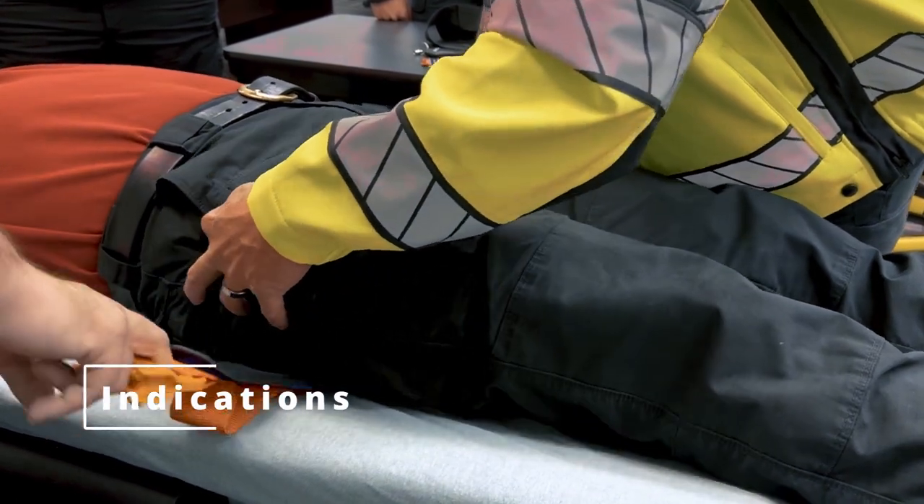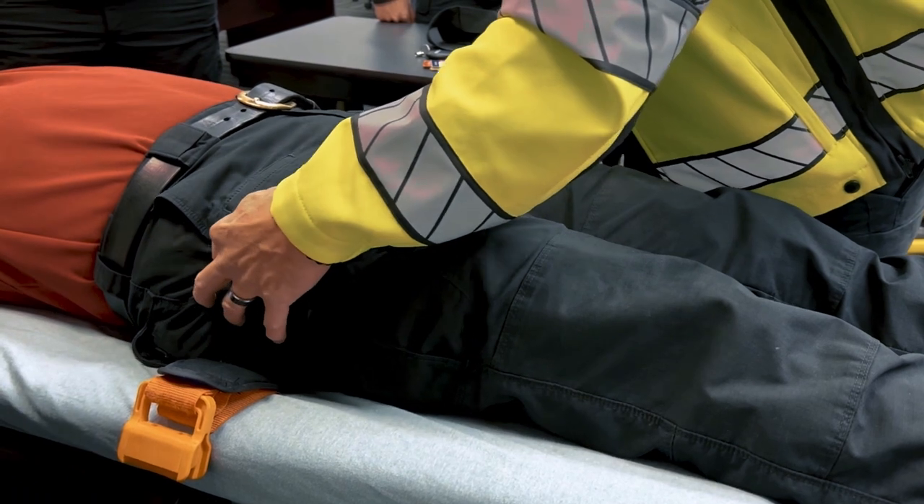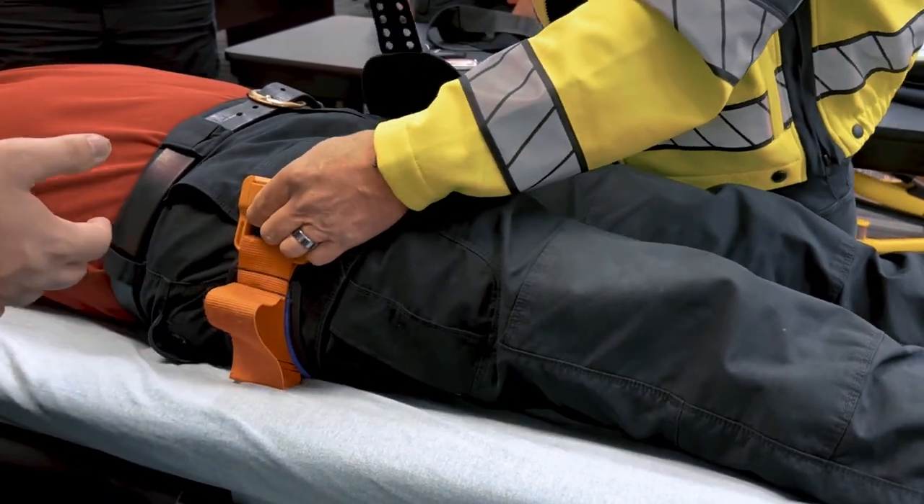A pelvic binder is indicated in cases of suspected pelvic fractures, typically resulting from high-energy blunt force trauma such as MVAs, falls, or crush injuries.